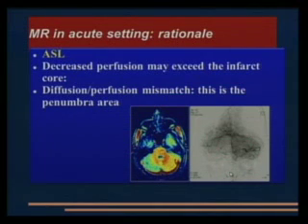We have this method, the ASL, that is the perfusion without injecting any contrast. But it was cumbersome to do. We only had one slice, and we had to calculate ourselves. So we don't do anymore. Now the new machines, they have ASL in the protocol, but I don't know.